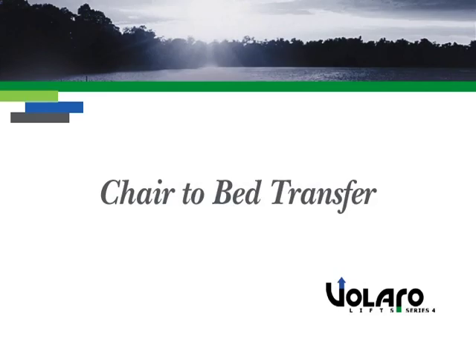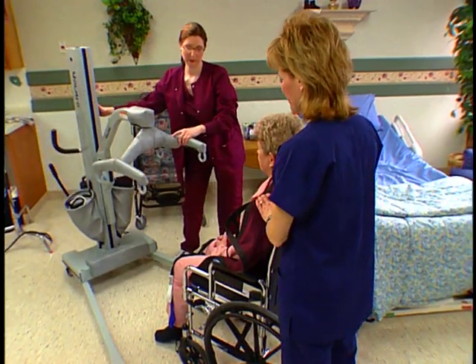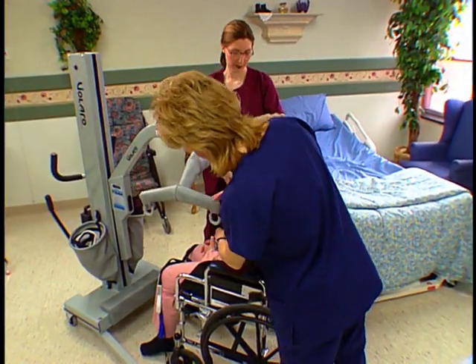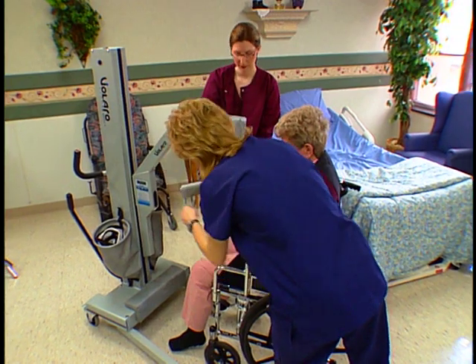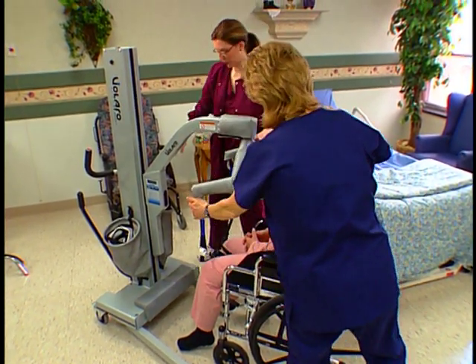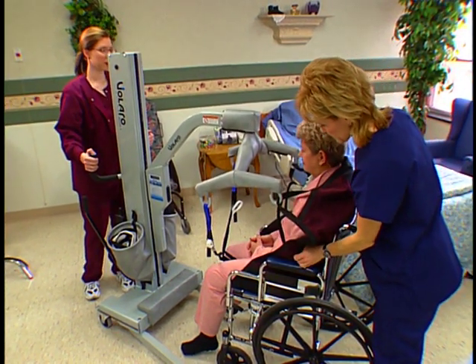Chair-to-bed transfer. With the sling properly placed, set the brakes on the wheelchair. Open the lift legs, roll the lift forward, and lower the hanger bar until it's at the resident's shoulder level. Set the brakes on the lift and hook the sling loops to the J-hooks on the hanger bar. Double-check your connections. Tell your patient that you are about to lift, then begin lifting.